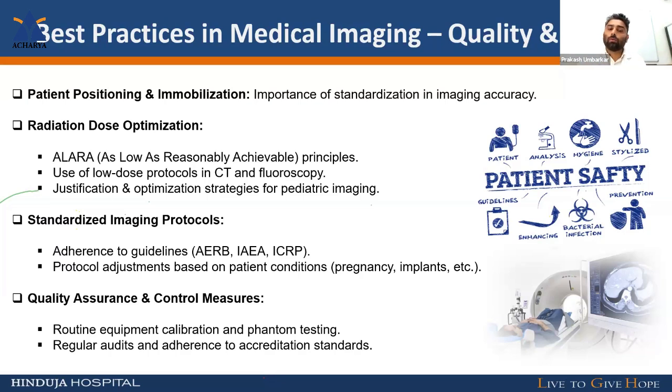Then ask, and then proceed with the treatment. Then the standard protocols: what protocol does the AERB give? What protocol does the IAEA give? What protocol does the ICRP give? Just follow these and implement them in your daily practice, and accordingly adjust your protocol and implement your SOP also.